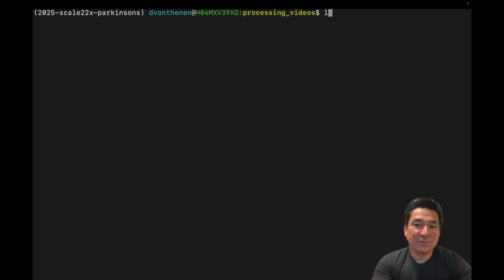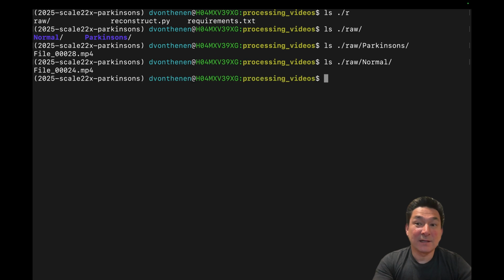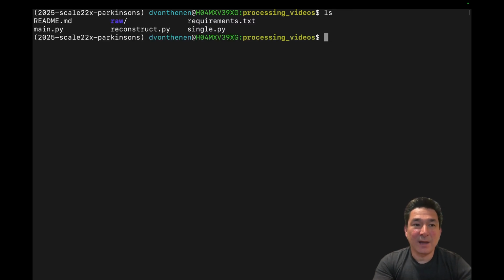As you can see in the directory here, we have a couple of videos, one for Parkinson's, and another one here for a normal walking pattern. To start off the process to convert into CSV, you can just run main.py, and it'll do the video conversion to CSV file, doing all of the feature engineering of all the things that we're interested in, specifically for Parkinson's disease here.